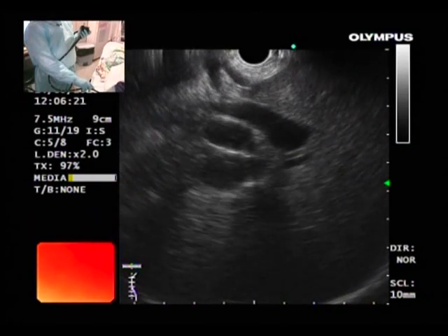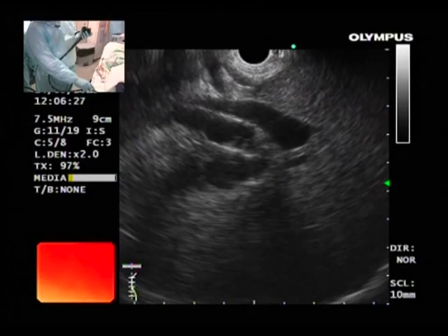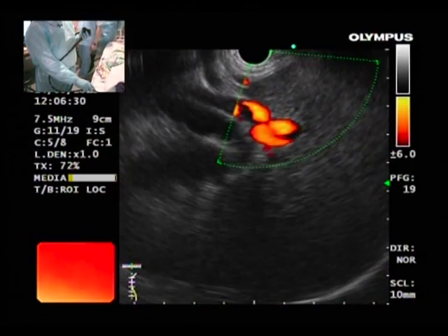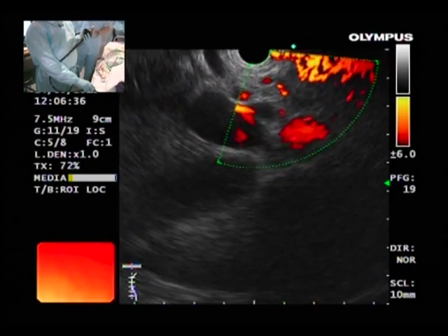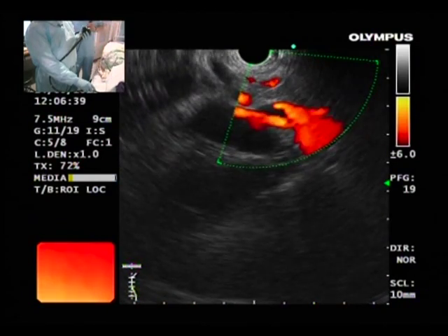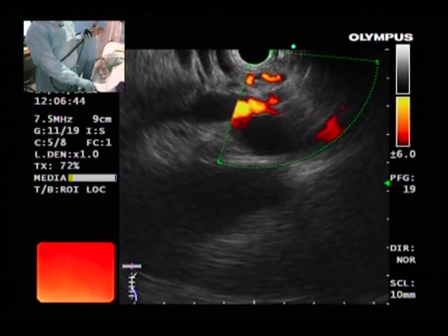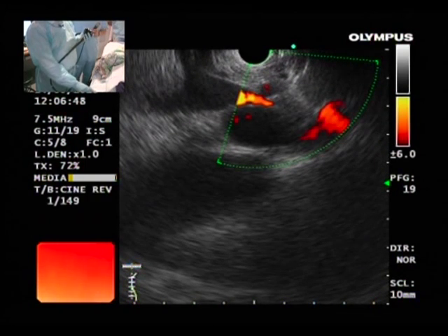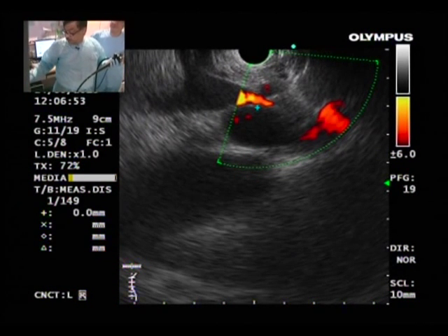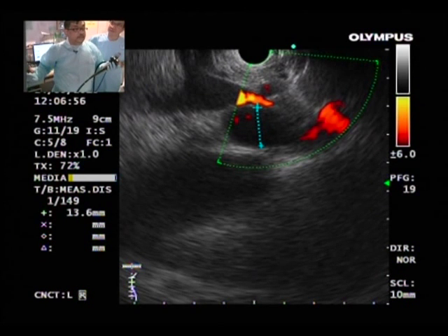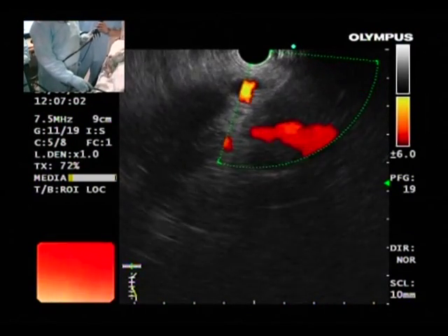If we apply Doppler, we will see the structures at the hilum. That is the portal vein which has lit up. Above that is the hepatic artery — the small narrow structure. Below it, the hugely dilated structure is the common hepatic duct, not CBD. Measuring it here — it is 13.6 millimeters. So it is a dilated bile duct. This is what we see anteriorly.